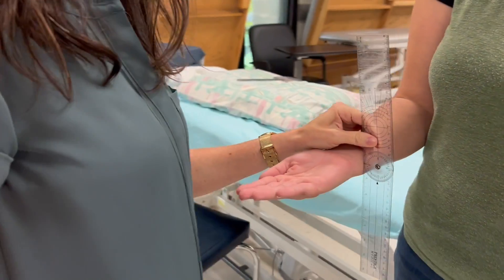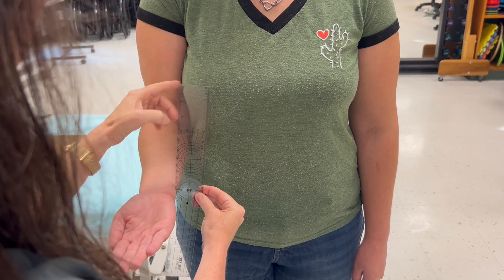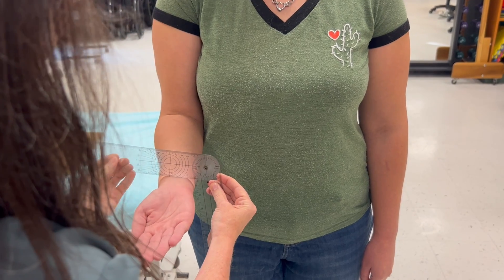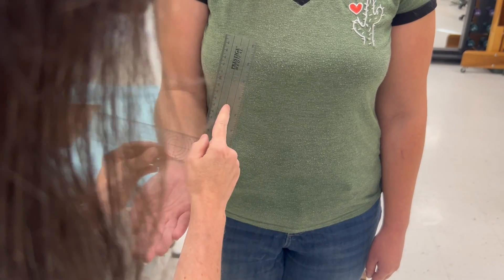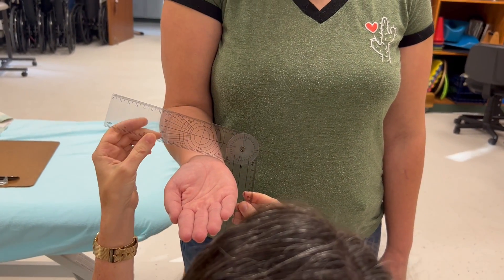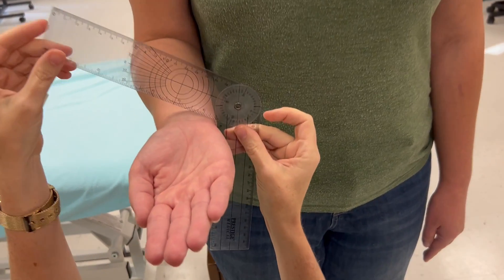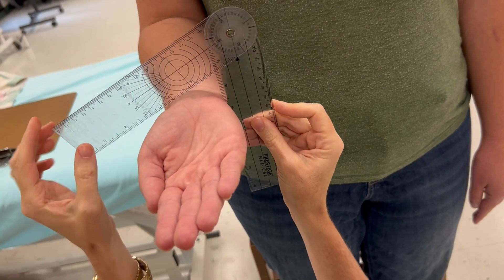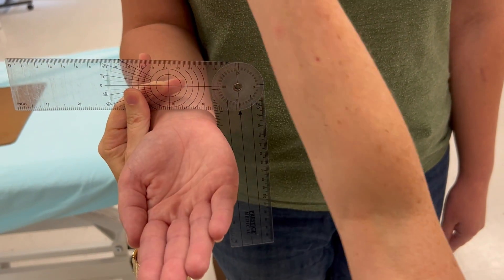The stationary arm is parallel to the anterior midline of the humerus, and the moving arm is going to go across the radius and ulna. You can have this arm down or up — a lot of people find it easier to go up because it's closer and they can see if it's parallel. You need to make sure the moving arm is equally across both bones — not just on the ulna and not just on the radius. It needs to be equally across both, and the stationary arm needs to be parallel with the anterior midline.